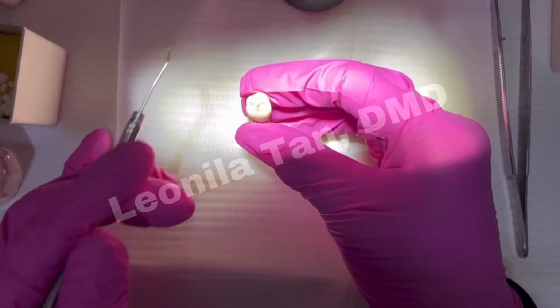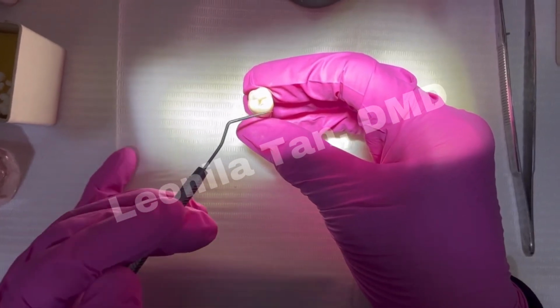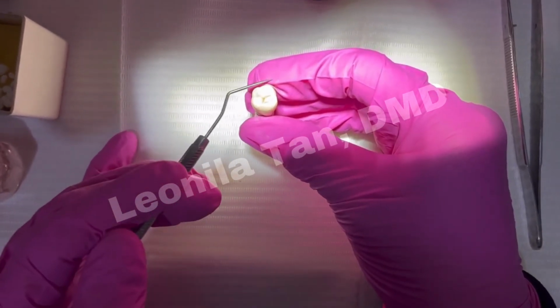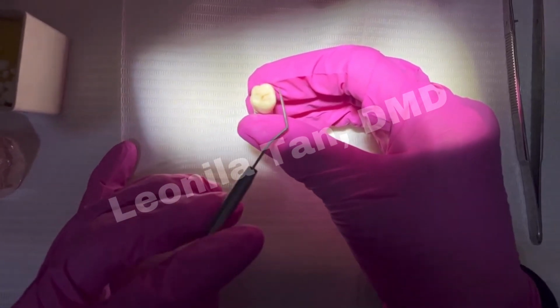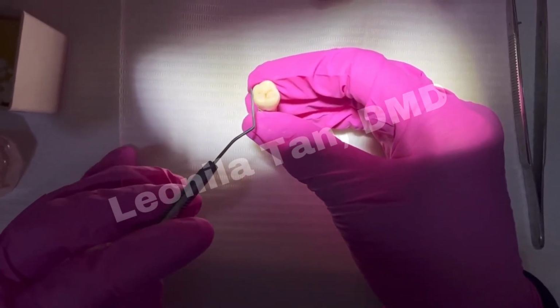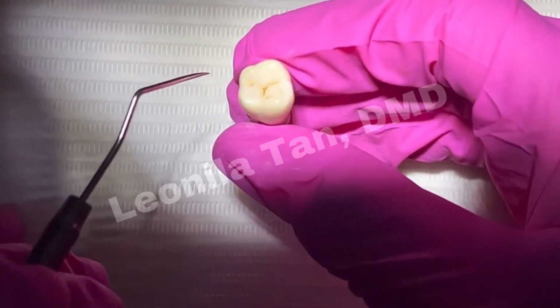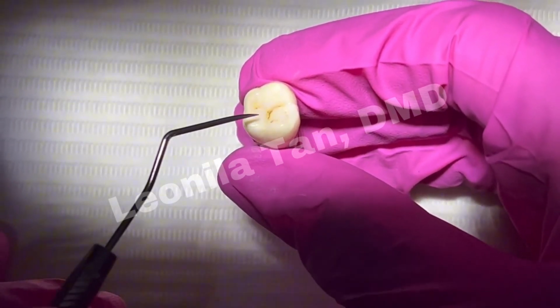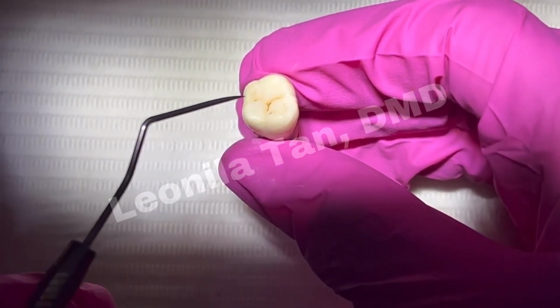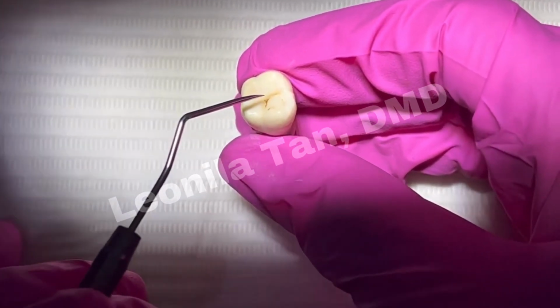So if we look at this second molar, which I am using as the model, we have here the buccal side, the palatal or the lingual side, the mesial side, and the distal side. The common access form for maxillary molars is triangular if there are only 3 canals or 3 roots.